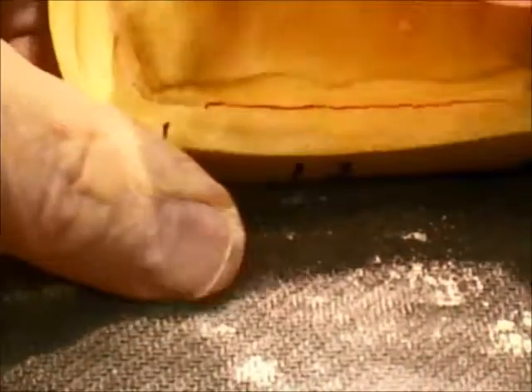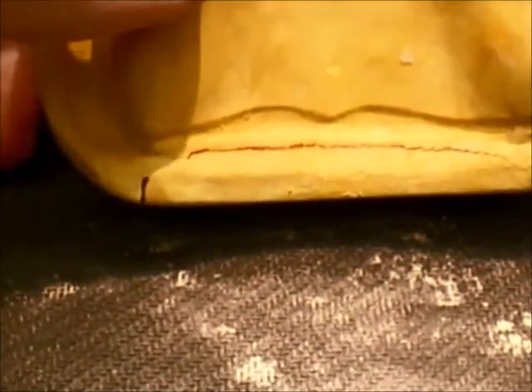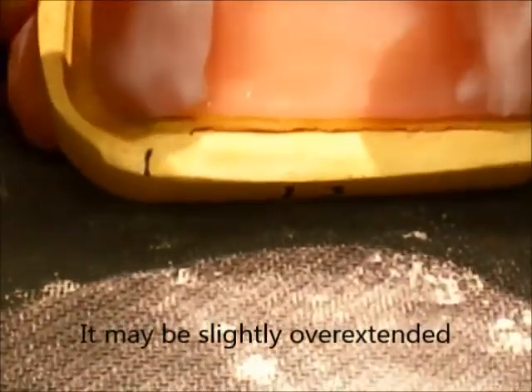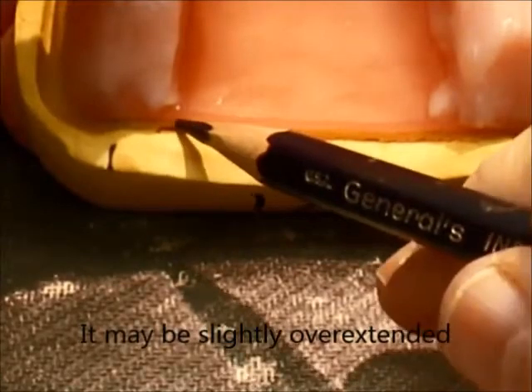Another mark is placed, and you can see this one is still a little bit overextended as well. We will take the acrylic burr and make that adjustment. This can be done prior to the try-in.